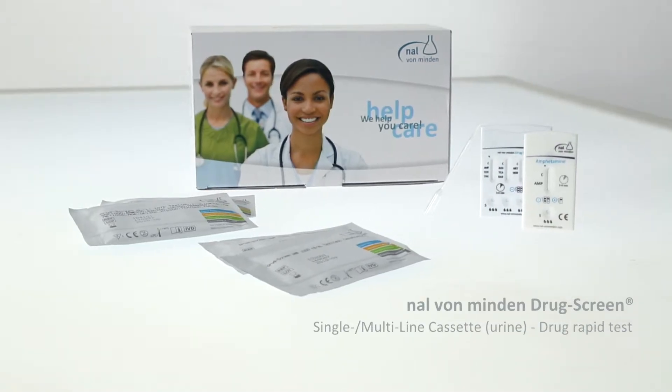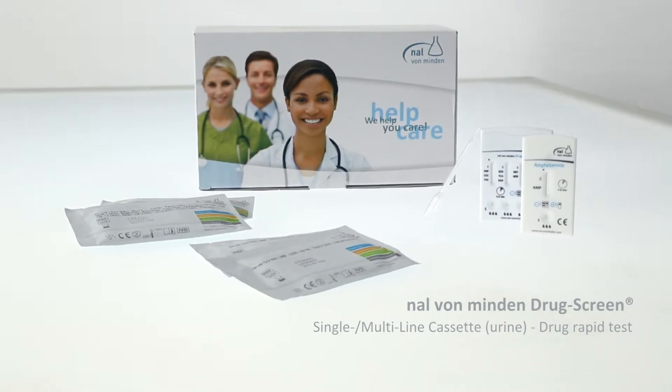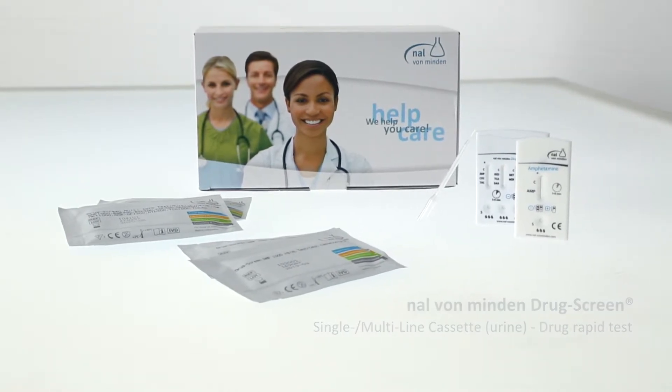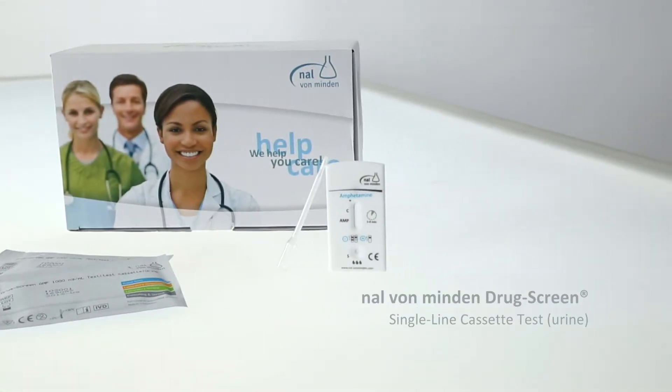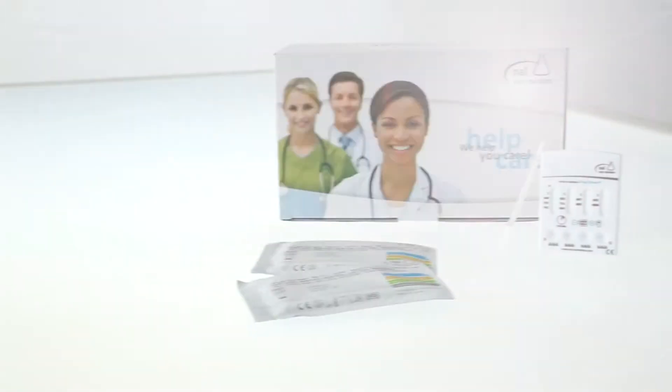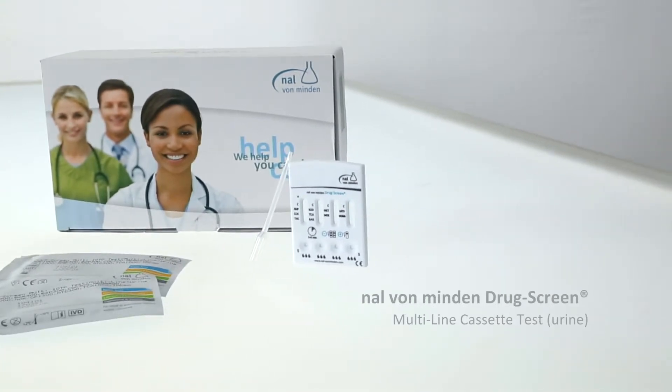The Nal von Minden drug screen rapid tests detect various drugs and drug metabolites in human urine. They can be used as single tests or integrated into multi-test combinations.